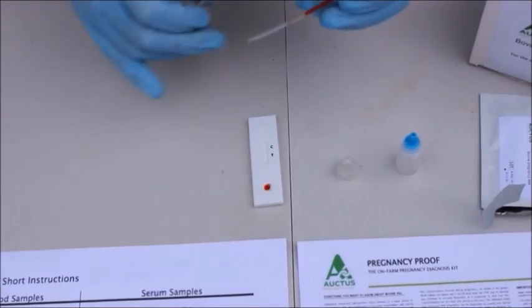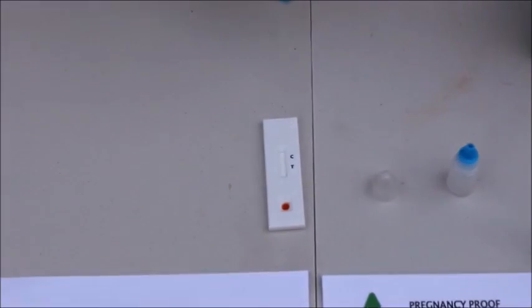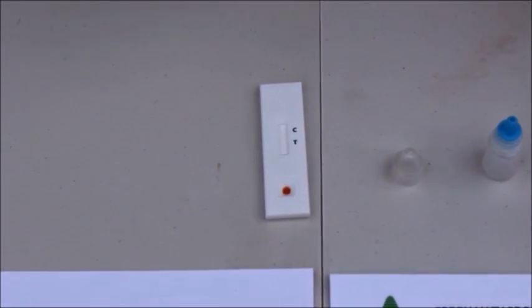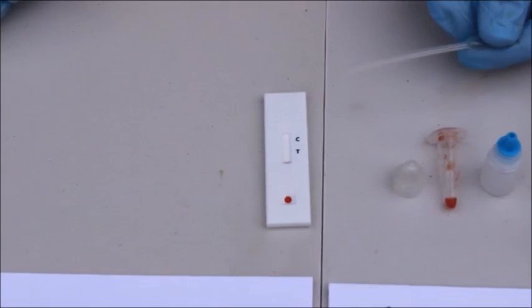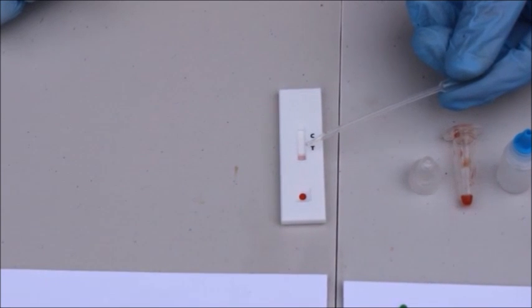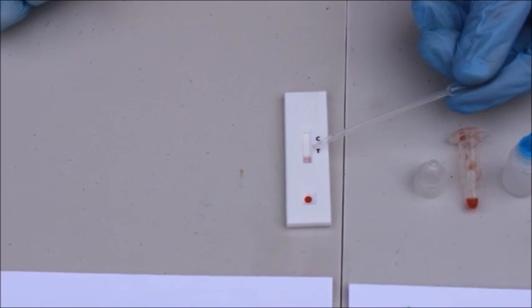We basically have to wait now until the solution works its way up through the test cassette. This can take a few minutes. We can start to see now on the test cassette the solution working its way up through the cassette from the well.